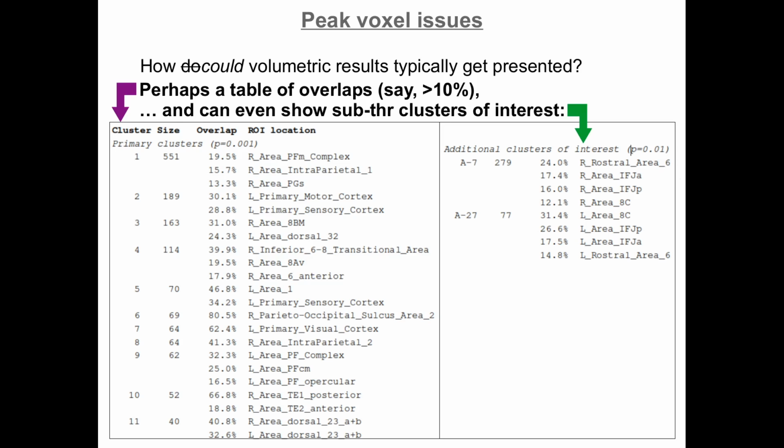And people immediately might say, well, that's arbitrary, how do we know? But again, there is a lot of arbitrariness involved. And as researchers, you should be able to make the case for your extra regions of interest and leave that up to the scientific community to decide that in the review process or in questions and discussions. But this allows for more informed discussions. And it's hard for me not to think that showing more information in a reasonably digestible way is going to be better. Standing by choosing p of 0.001, that just seems so arbitrary. It's a little frustrating that it tries to shut down conversation.